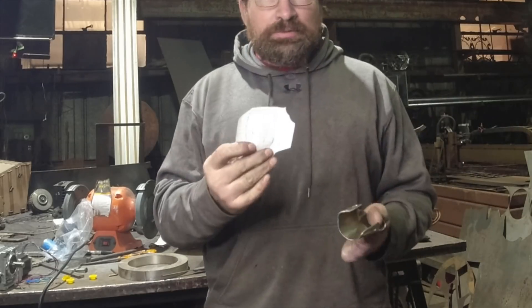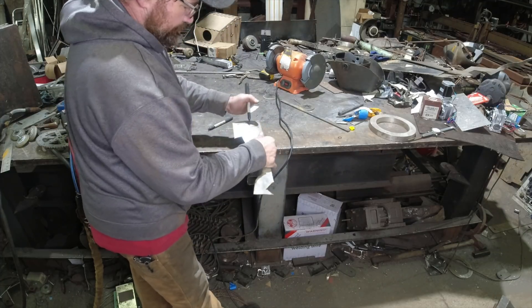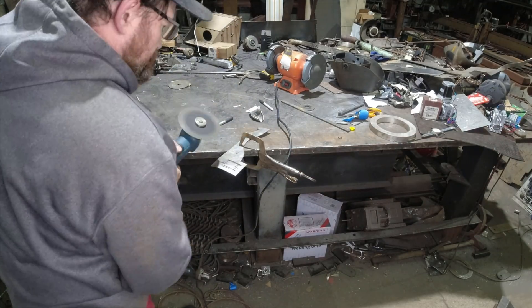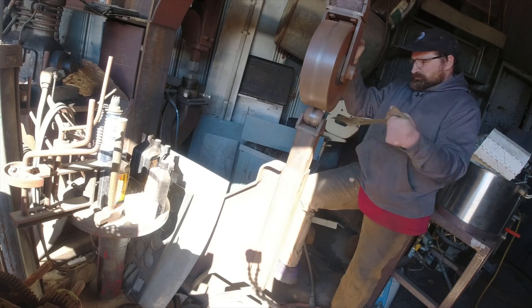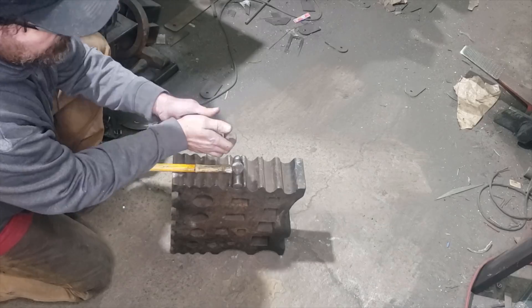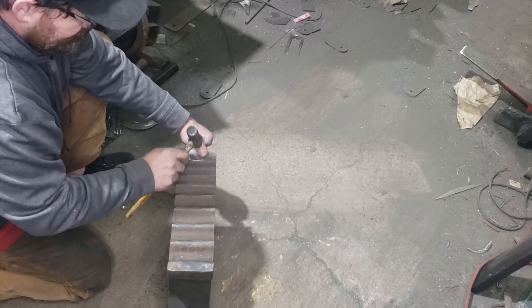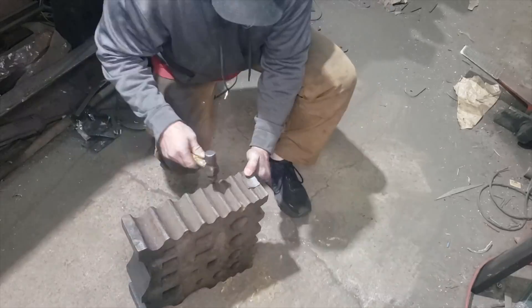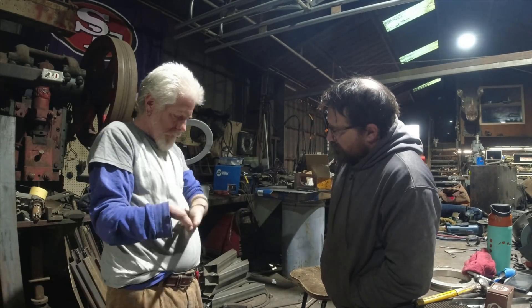We started out by making a paper template of the socket area and transferring that shape to a piece of thin sheet metal. From there, I rough cut the profile and started forming it around a piece of tubing. Once we got the socket portion to fit Jim's thumb, we could start laying out the tool portion. We started out with the pen holder side, and once we figured out a rough shape that worked, we turned to the scoop side.